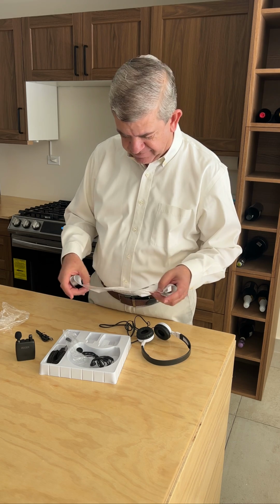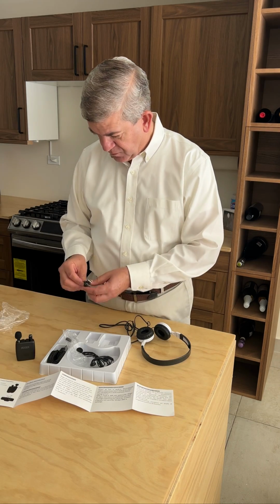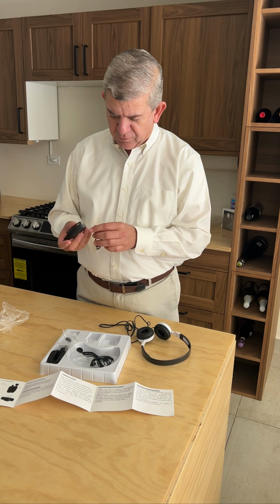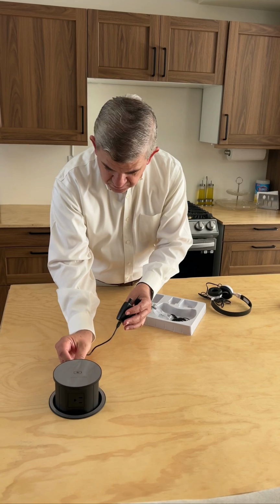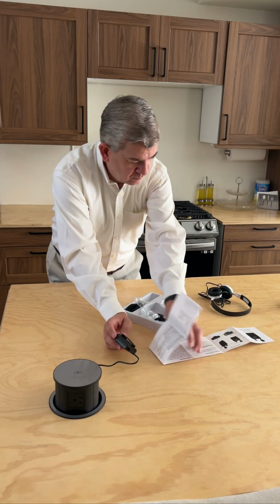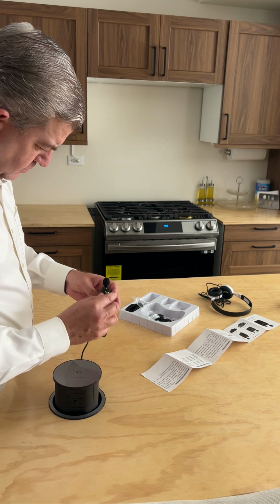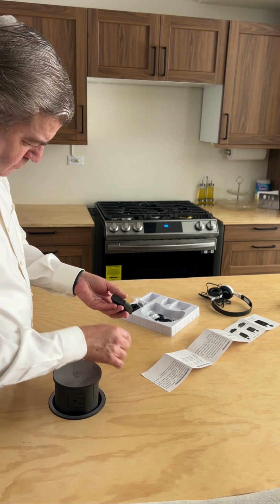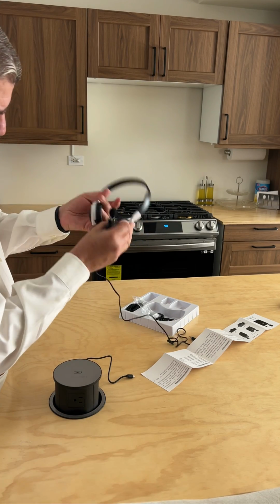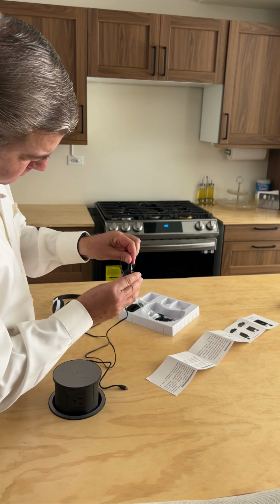Okay, this is a hearing amplifier. You just have to charge it with this micro USB. We're going to connect it here. As you can see, it is charging. You turn it on with this dial and you put the headphones, you connect them here.